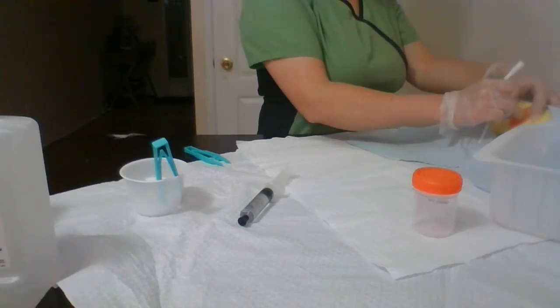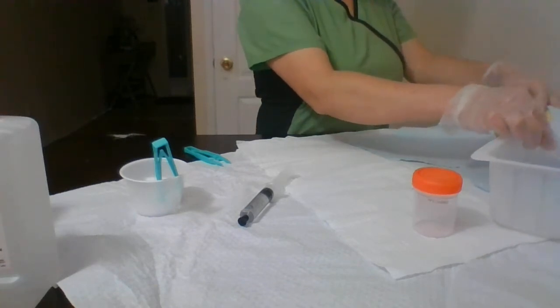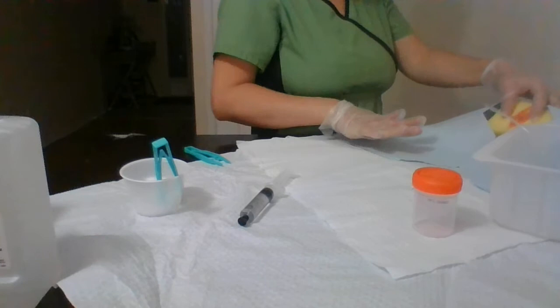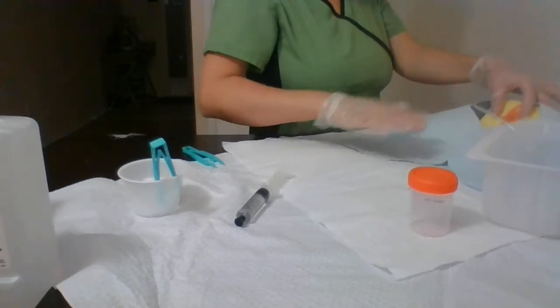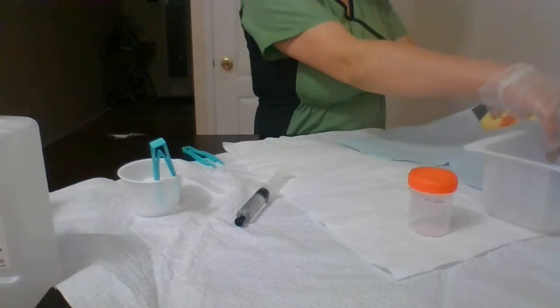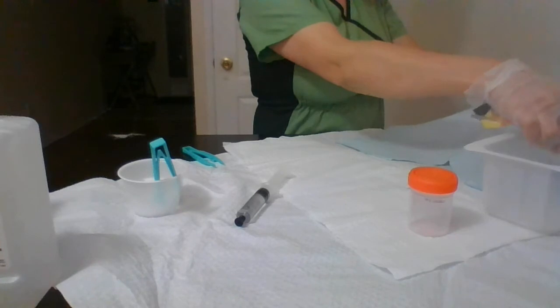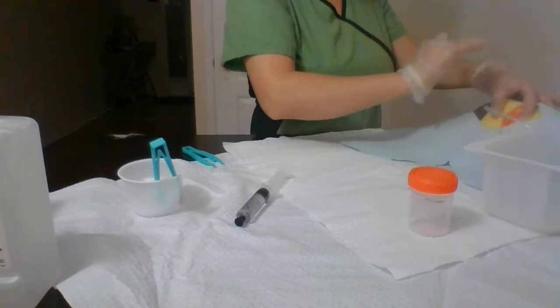And then once I see the drainage, I will proceed another 2.5 to 5 centimeters. Okay. So the catheter is well placed.